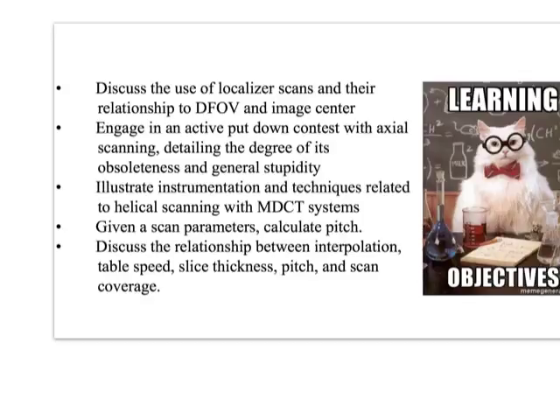We're going to illustrate instrumentation and techniques related to helical scanning with MDCT. That means multi-detector CT scanners. Basically every CT scanner you will ever work on, you could call MDCT, so it's kind of obsolete, but that's the terminology she uses in the book. We can just call it a CT scanner.